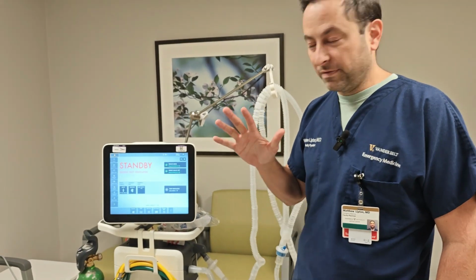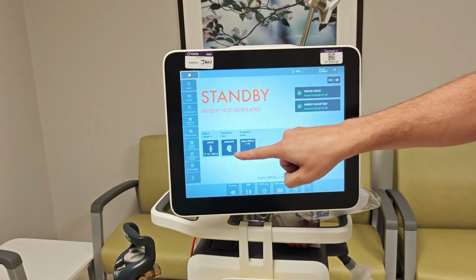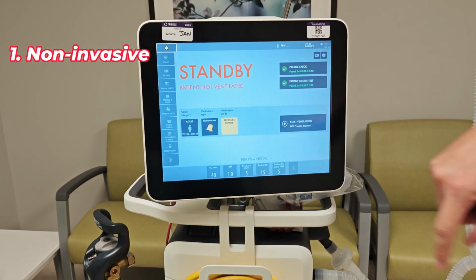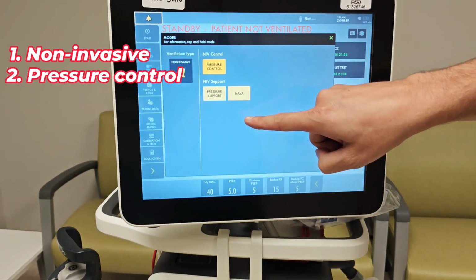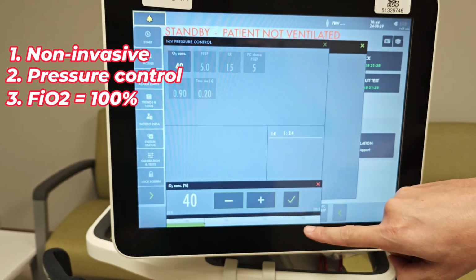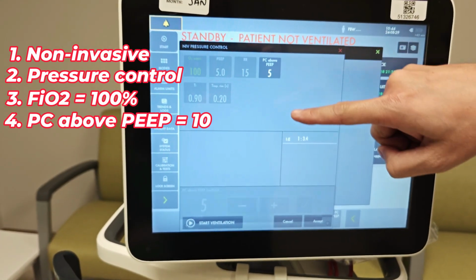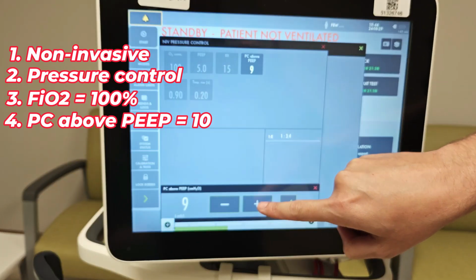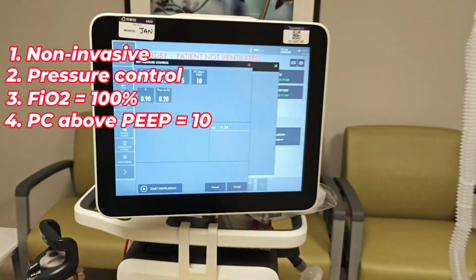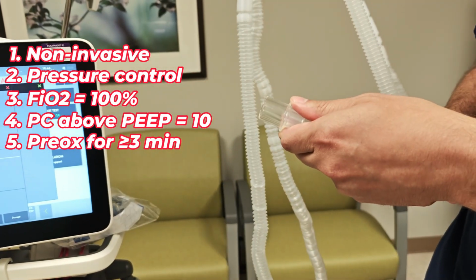All right, to summarize, there'll be 5 steps here to hook a patient up for non-invasive positive pressure ventilation prior to intubation. You'll switch invasive to non-invasive mode. You'll click same patient circuit. You'll go from pressure support to pressure control. Number 3, you'll change the FiO2 all the way up to 100%. Your pressure control above PEEP will go up to 10. You'll start the ventilation, and then you'll hook up the patient to the mask for at least 3 minutes prior to intubation.